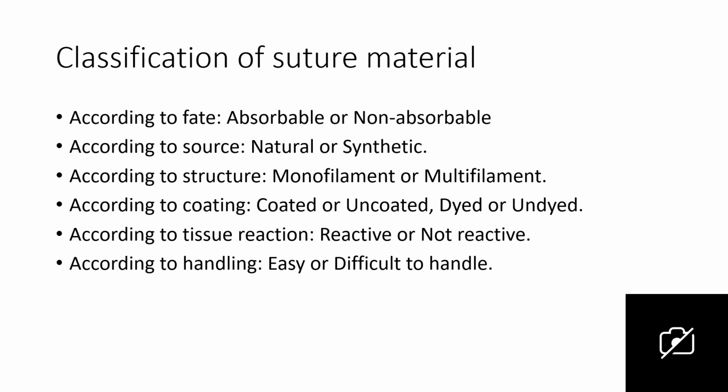According to tissue reaction, is there any reaction while using the suture, or is there no reaction? According to handling, is it easy or difficult to handle the suture? Is it thick, or is it plastic or elastic?